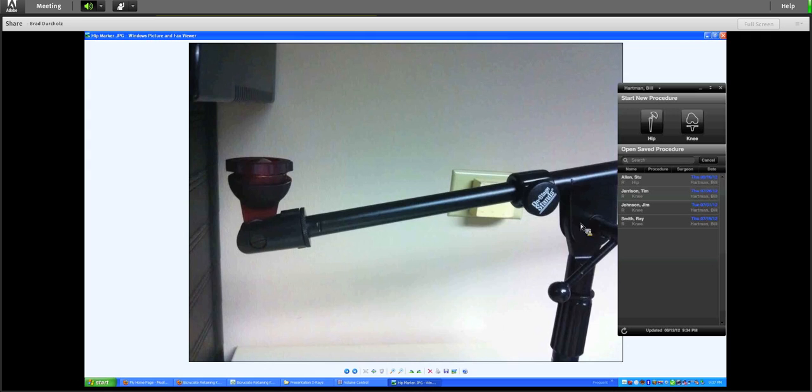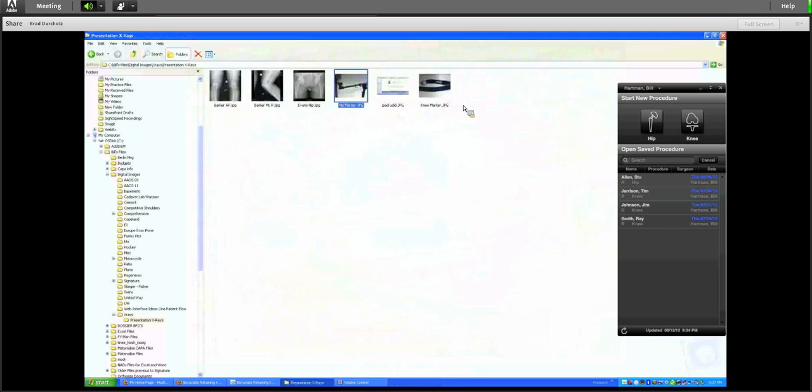So the idea is we would get the position. This stand would be sitting on the table. We lock it in place. Then we take the ball, move it into the center of the patient to get into the middle of the field of view. And because it's locked in place, we didn't change the height of that ball, and that's going to give us the accurate reading. This one I think is still slightly debatable in terms of how this is going to work, but it's one that we want to look at.